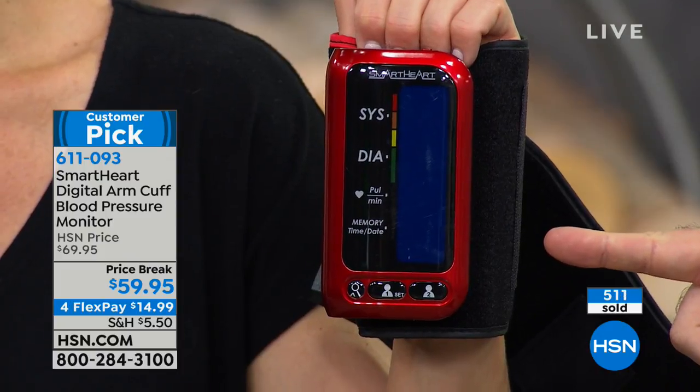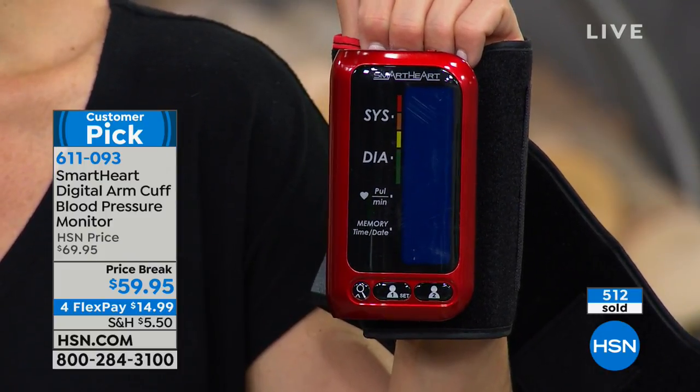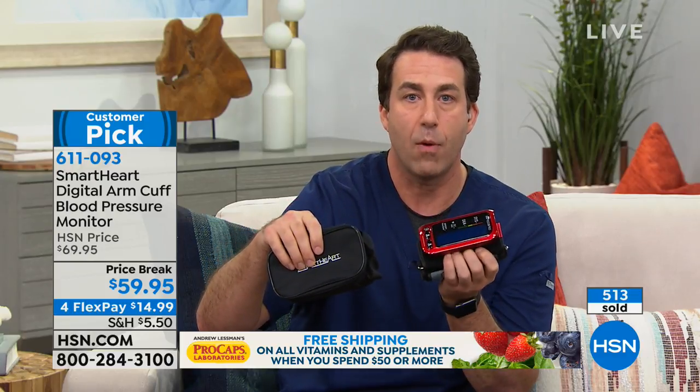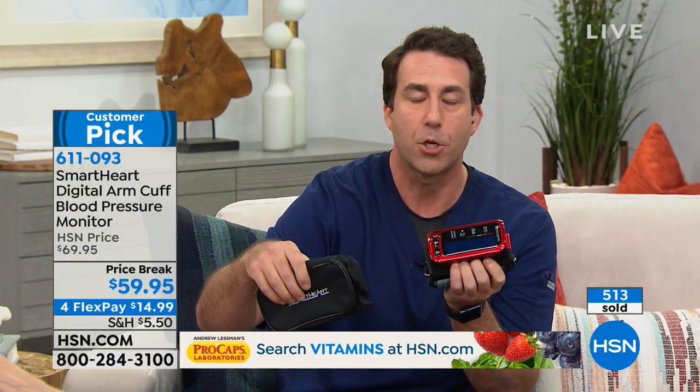Now see that auto shut-off — that's another feature that helps you conserve battery power and maintain battery life. When you get this home, everything is included. You have a carrying case; it's ultra discreet — you can take this anywhere, and no one knows you have it on you. You can take your blood pressure readings in private. It comes with a charging cable, so no batteries to purchase ever. Simply plug it into the wall and charge it up for about an hour or so. Keep that charge full all the time and you'll never have to worry about inaccurate or unreliable readings because your battery is drained.